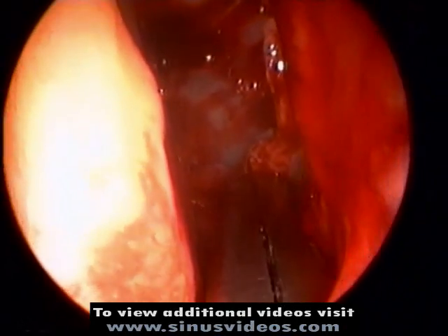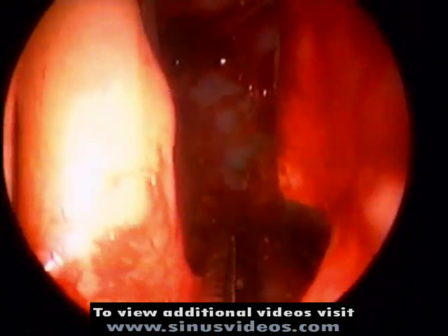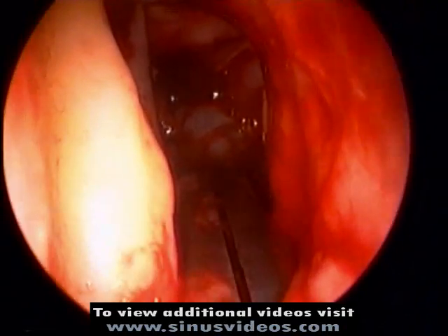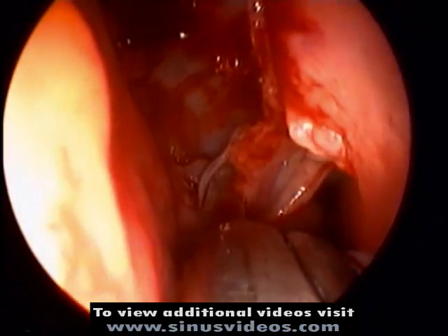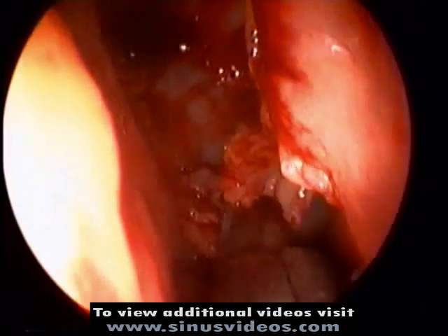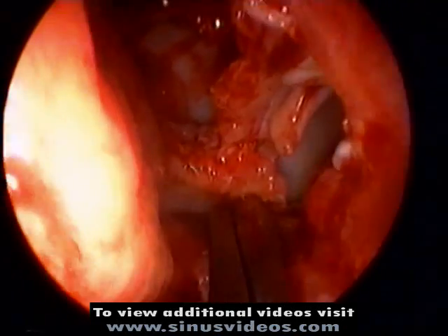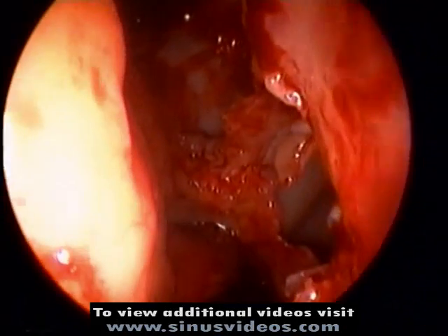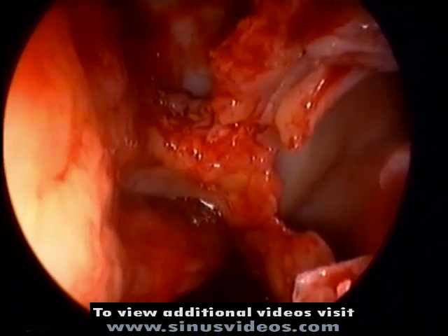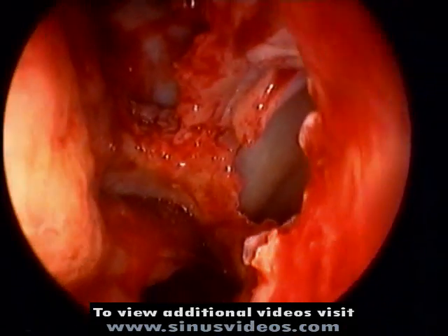The exposed maxillary ostium is enlarged in an anterior direction with backbiting forceps. Care is taken to only remove thin bone so as not to injure the nasolacrimal duct, which is almost always surrounded by thick bone and lies approximately 1 centimeter anterior to the natural ostium of the maxillary sinus. Once the maxillary sinus ostium has been sufficiently enlarged, the interior of the sinus can be visualized.